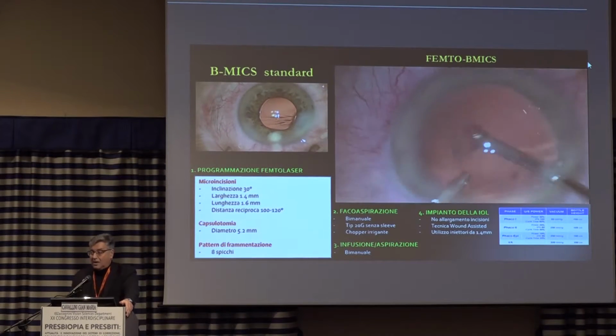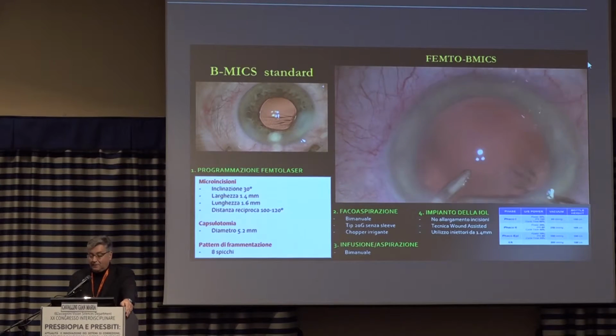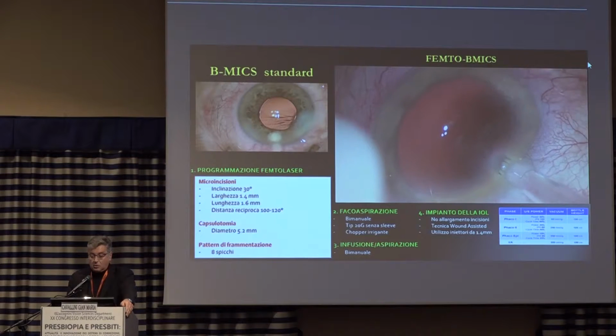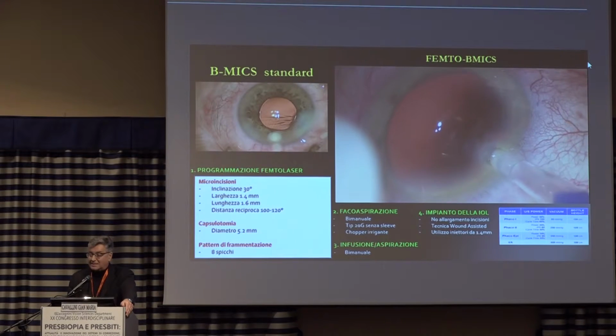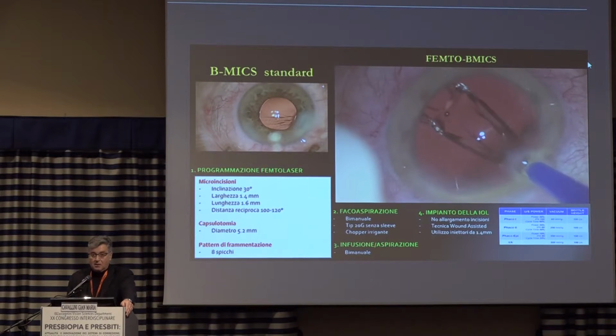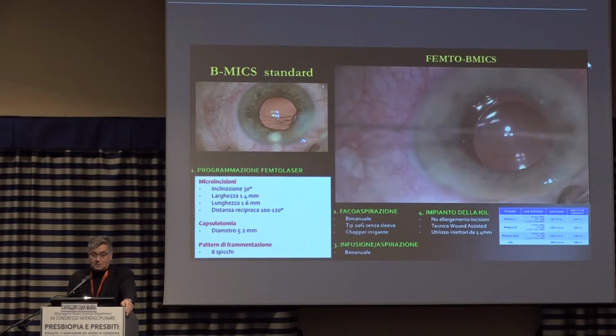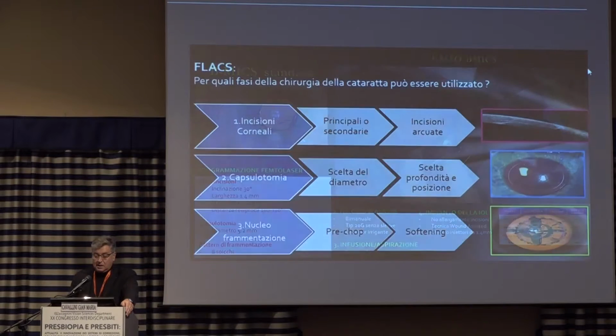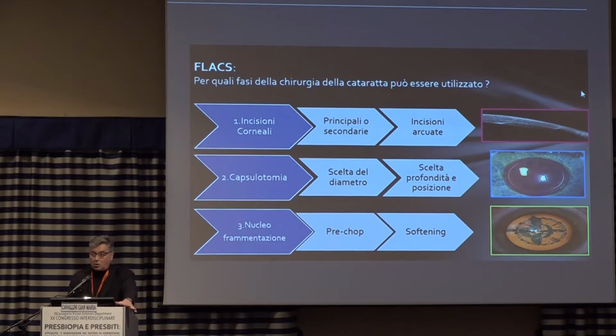After this first step, you go on as in common cataract surgery. I aspirated, then introduced the lens through these micro incisions, which I sutured with water.